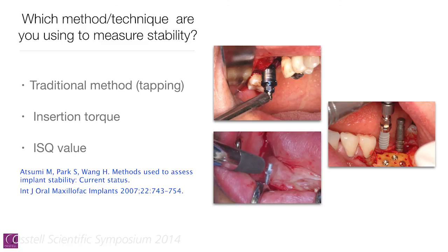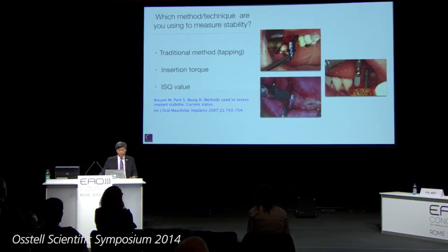We've already gone through the different ways of measuring implant stability. And as Dr. LeBlanc has indicated, insertion torque has been used quite frequently and for an extended period of time. There are many research projects that correlate the value of using insertion torque with predicting how the implant will survive or succeed.